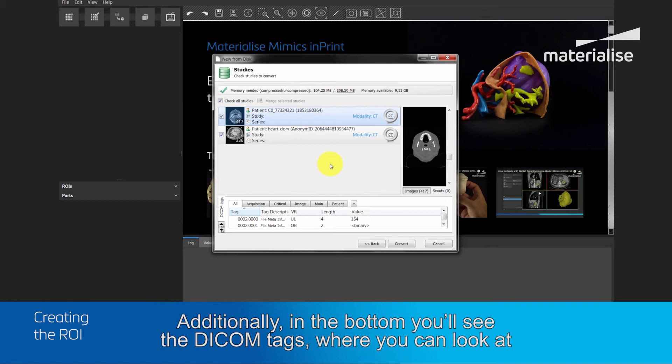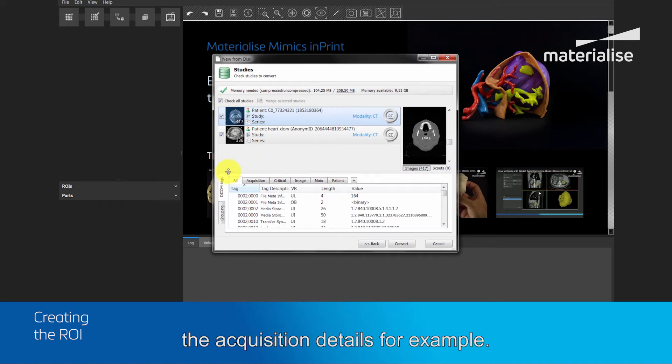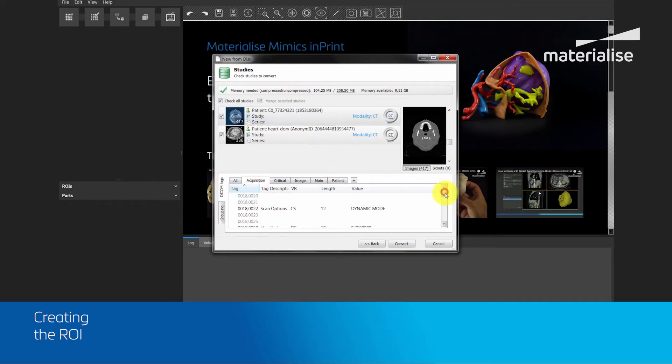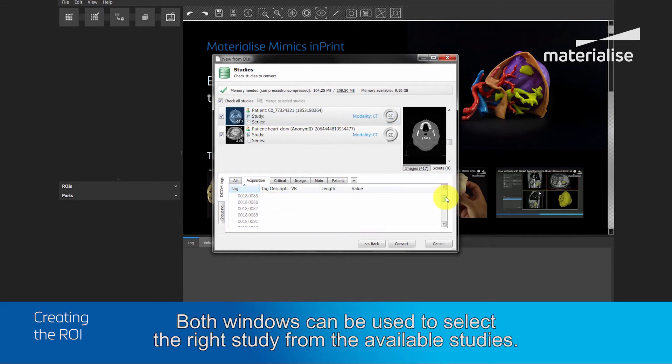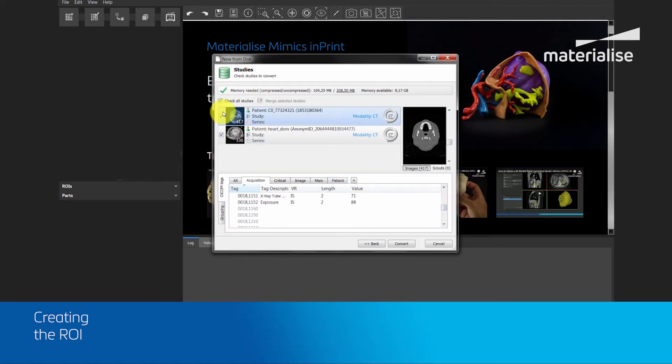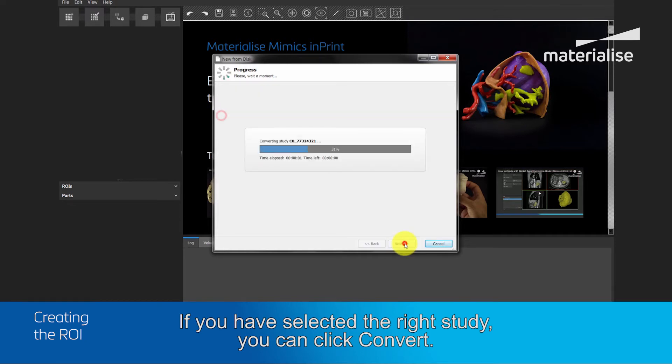Additionally, in the bottom, you will see the DICOM tags, where you can look at the acquisition details, for example. Both windows can be used to select the right study from the available studies. If you have selected the right study, you can click convert.